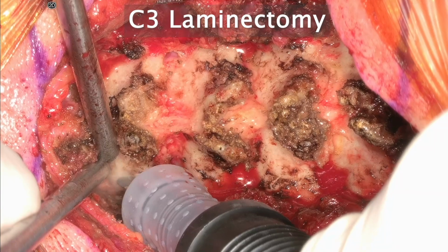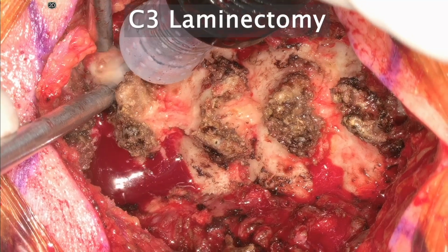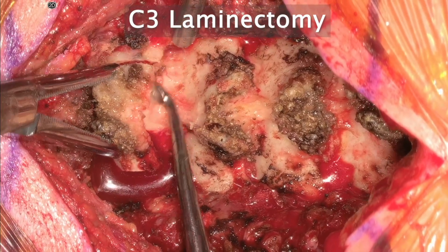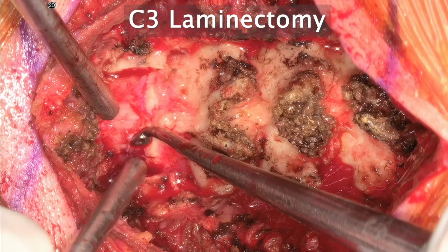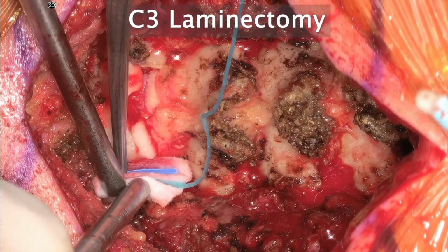Here we're performing our C3 laminectomy. First he went through with that Misonix bone scalpel, and then you can see now he is releasing some of that ligamentum flavum. Usually you do that a little bit below the lamina, which allows you to remove that lamina. Now, this technique is called the open door technique. And tell me the difference between how we treat the ipsilateral side versus the contralateral side.